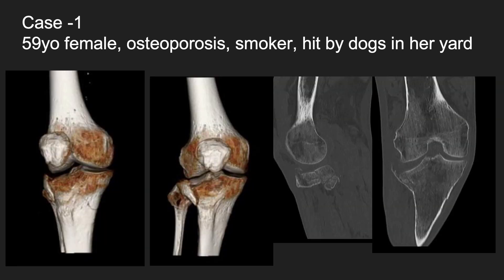This is a fairly typical case: a 59-year-old female with osteoporosis, walking her dogs in the yard when one of them rammed into her. You can see she's got what initially appears to be a Schatzker II fracture, but CT scan reveals medial column disruption. The CT scan on the far right shows a crack in the metaphysis — to me, this is the telltale sign of failure if you're going to use a laterally-based implant only.